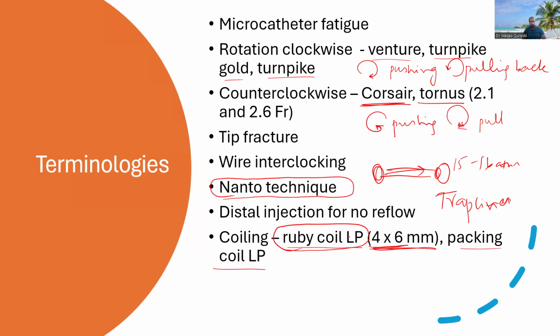In terms of using fat, you can make an incision in the groin and make it a deeper incision. Use your forceps to take a lot of fat out of there, like just rip it out. I know it seems very bad. Dip it in the contrast because you won't be able to see it in the microcatheter, and then fill the back end of the microcatheter with some contrast.